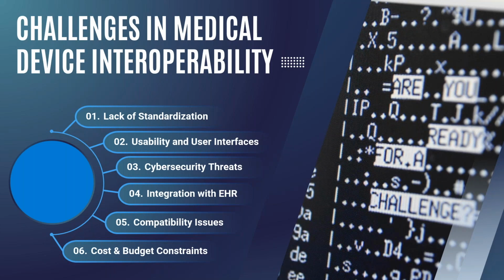And then challenges: cybersecurity threats. With the ever mounting cybersecurity threats, like AI, malware, people coming into your hospital, physical attacks, on the network attacks, ports and protocols, it's a never ending onslaught of cybersecurity. Plugging it into the hospital network, it could be open to the internet, who knows.